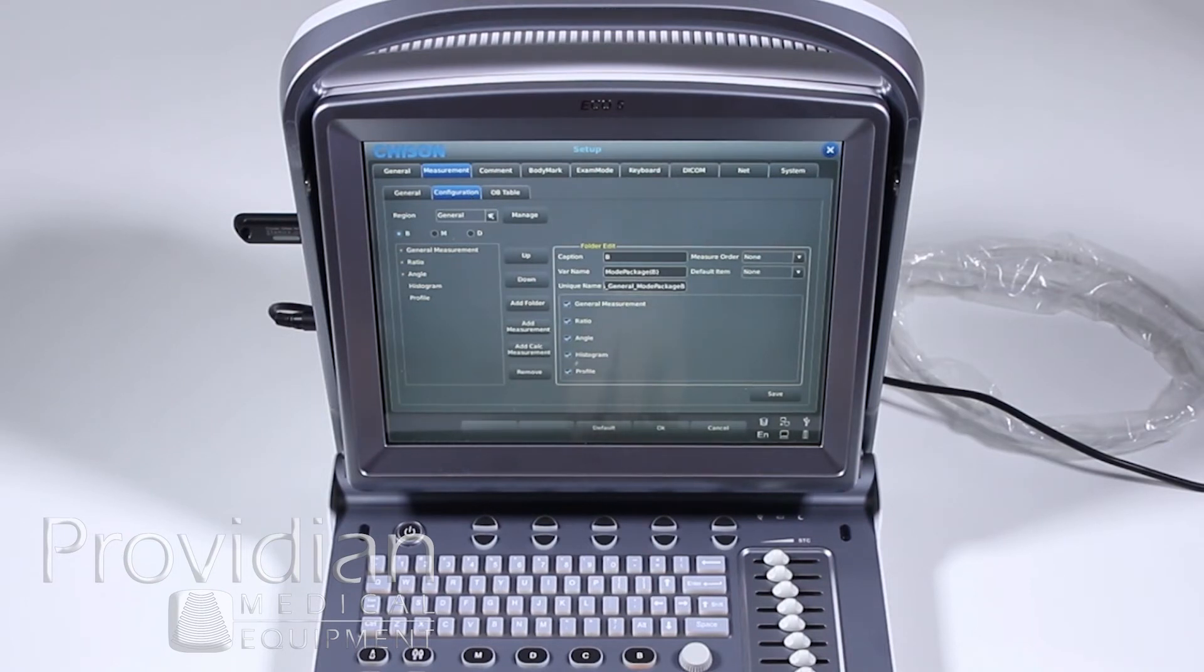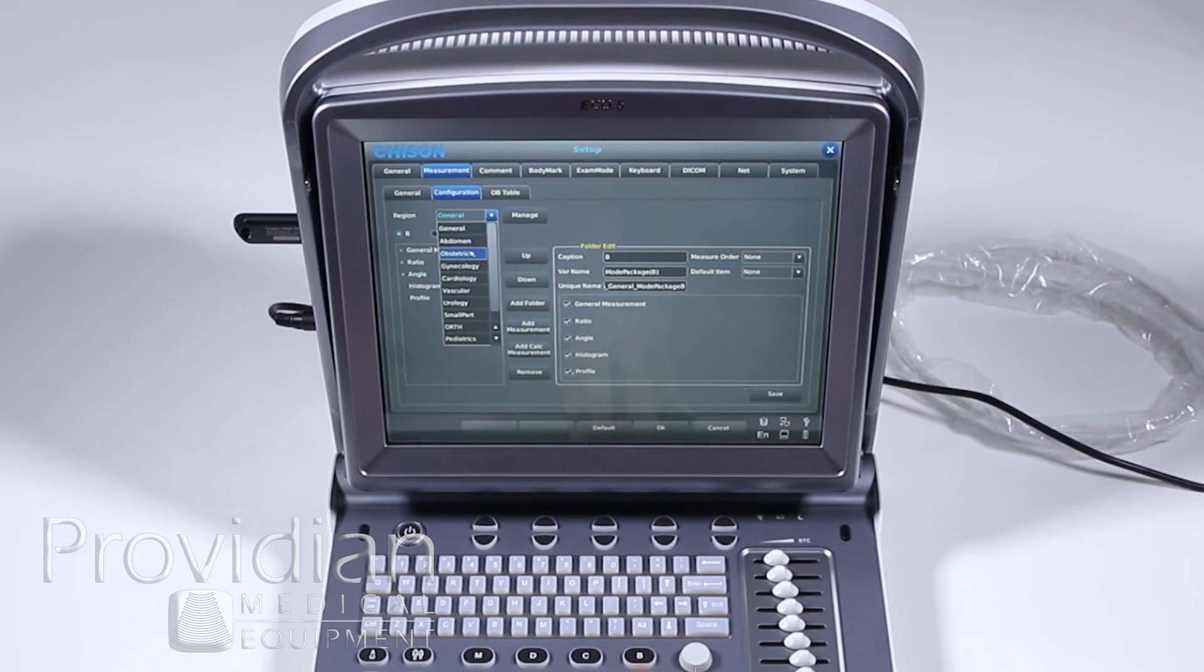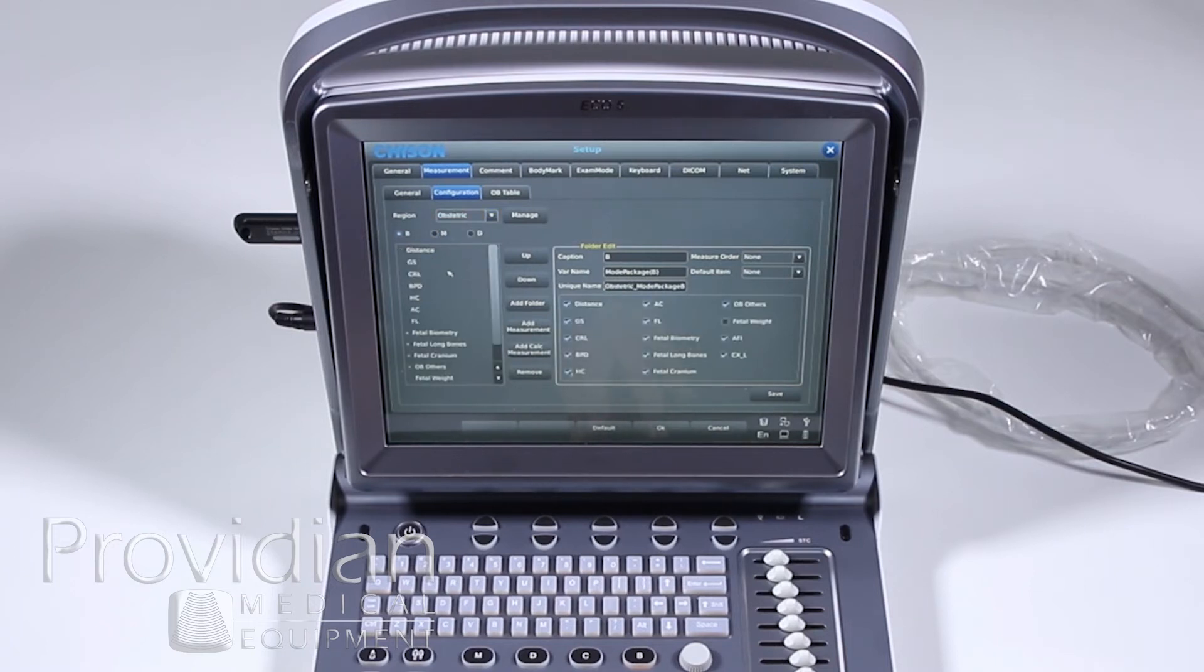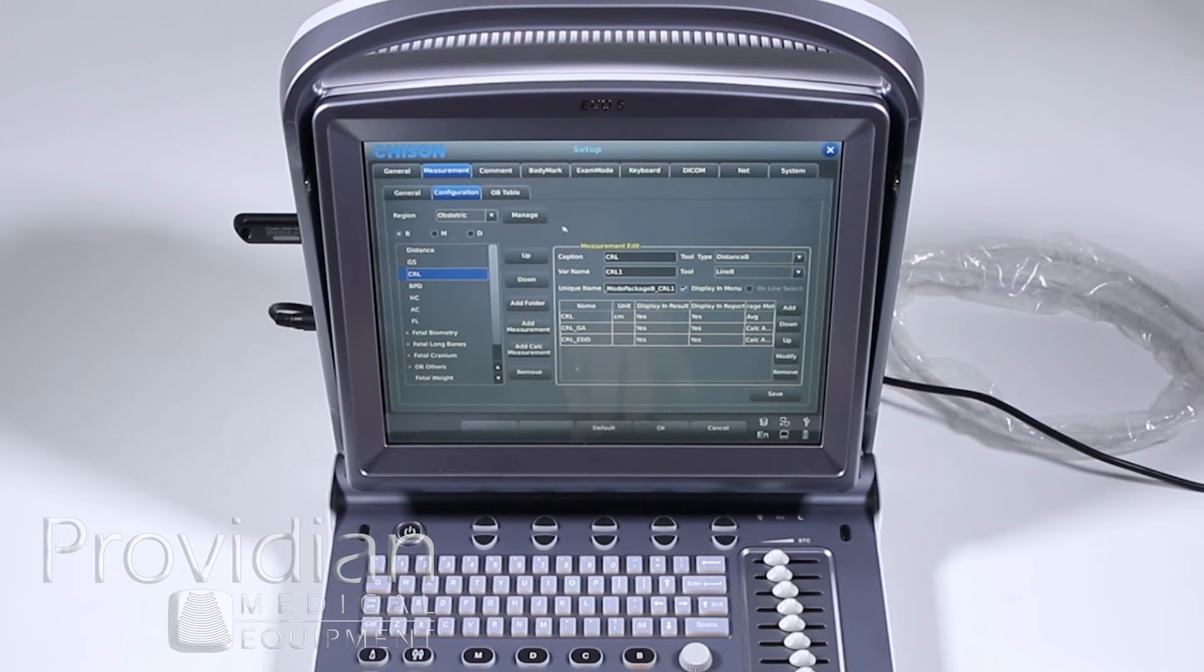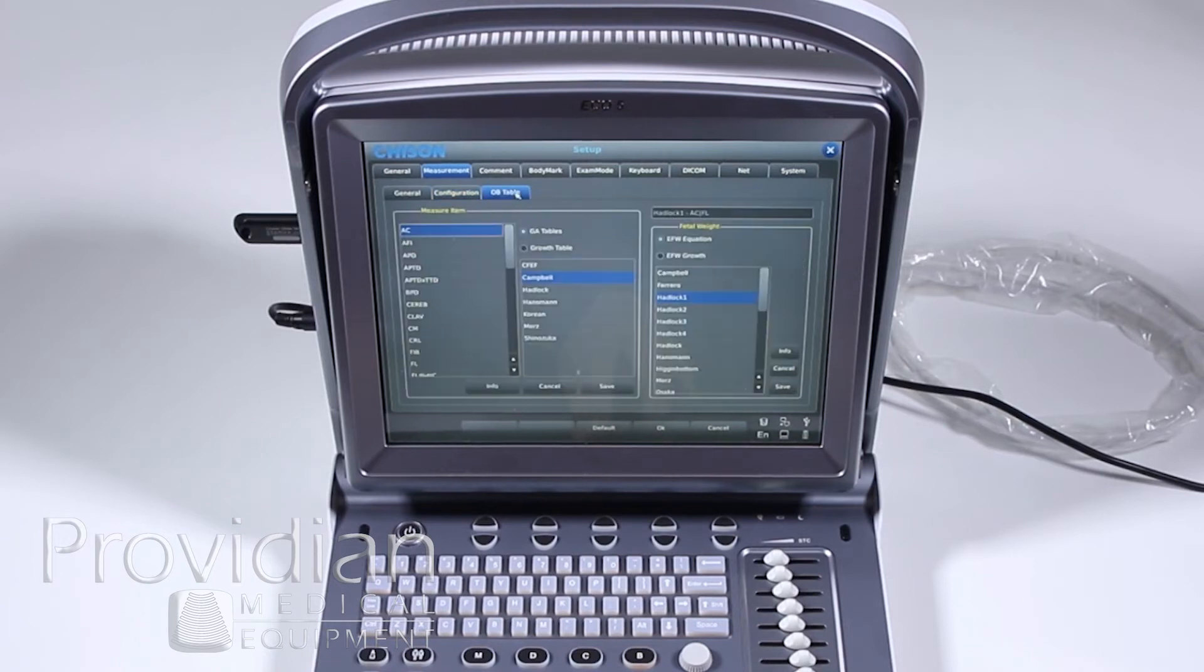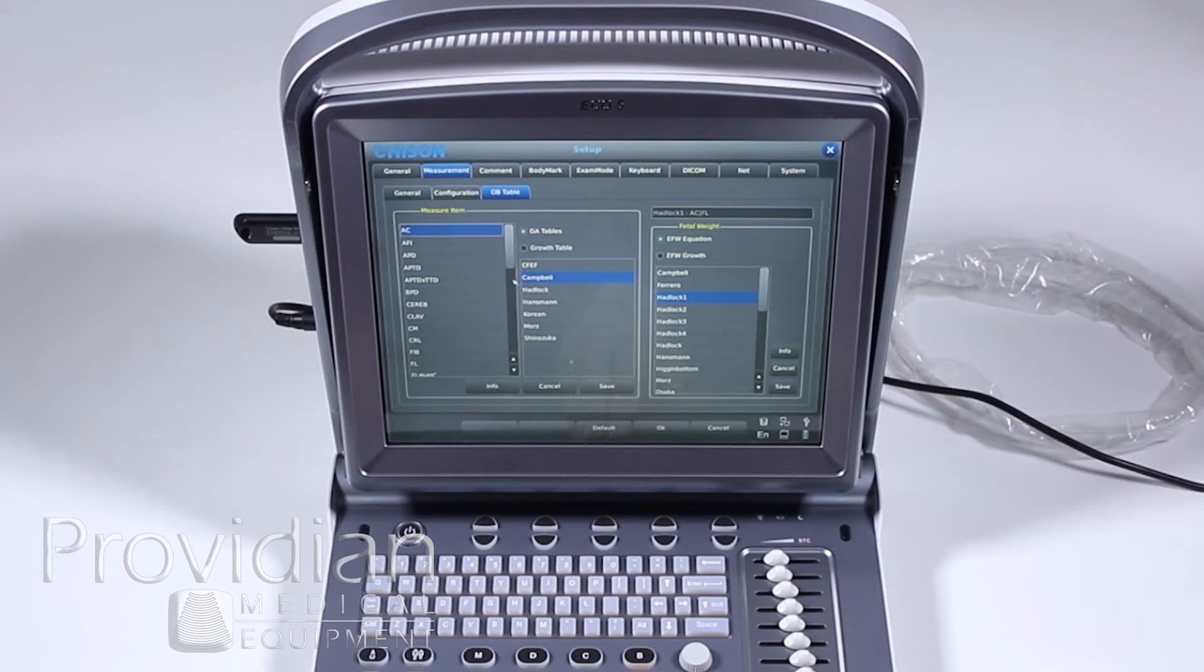This is beyond what I would do in this training, but you can set up your own library as to what shows up and where when you pop up that menu. You can actually remove or add calculations from this menu. And then once you do that, you can set your OB table as to how you want to headlock. Hadlock or any of that, how you want to customize that for each single measurement item.